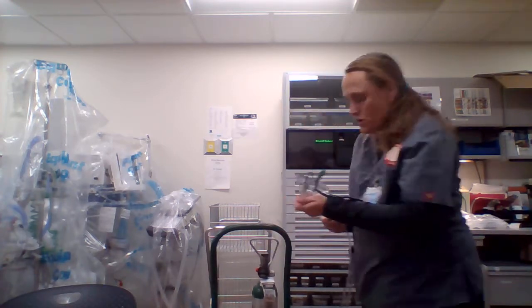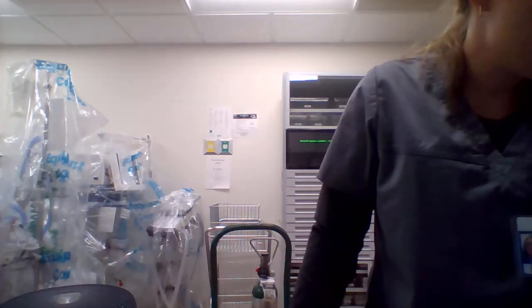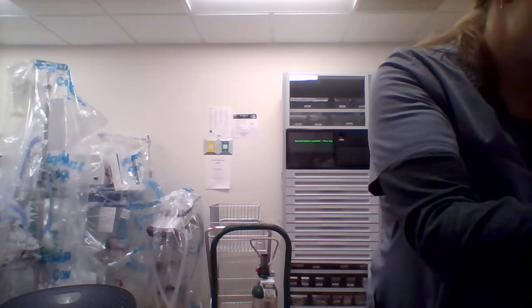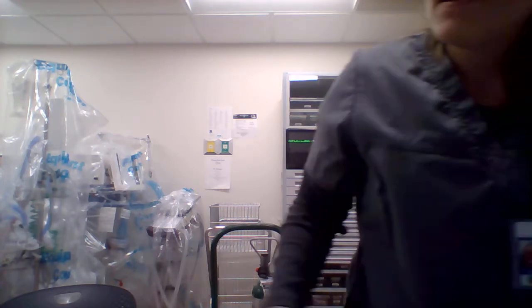With that device, you want to make sure that you're meeting your patient's flow. So we want to ensure that we are meeting their minute ventilation demands. And there's a snazzy equation for that. Which I lost. So let's say they're at 40%. Well, room air is 21%. So 100% minus 40 over 40 minus 21, 60 over 19. So I get a ratio of, I'll call it, 3 to 1.